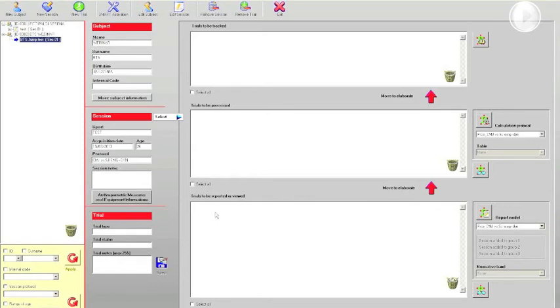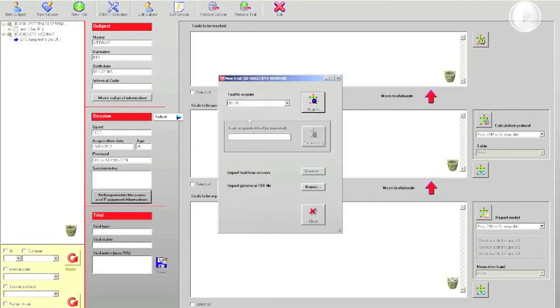As you can see here, the visualization, the display is quite similar. I already created my subject that is 26 years old. Here we can see the anthropometric measures. In this case, we need just the weight of the subject, that is 41 kilograms. Okay? The test will require, new trial, a first acquisition of counter movement jump and a second acquisition of squat jump.